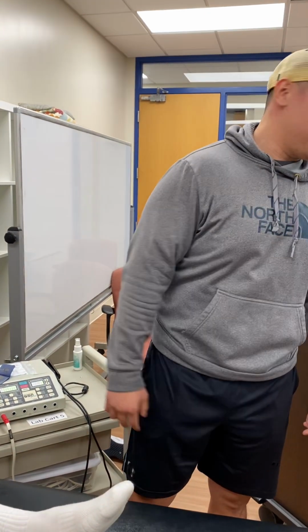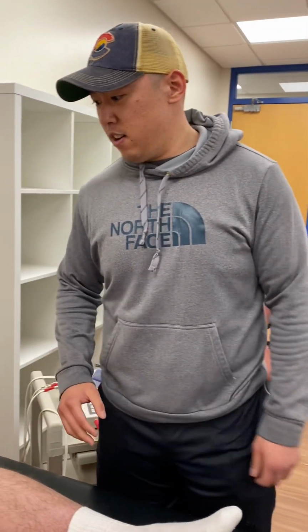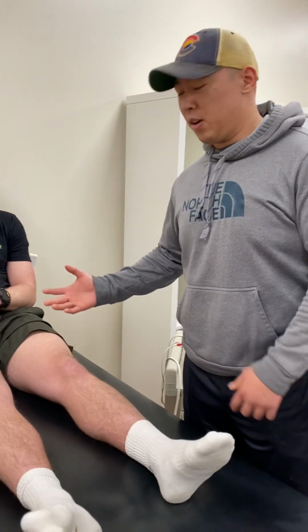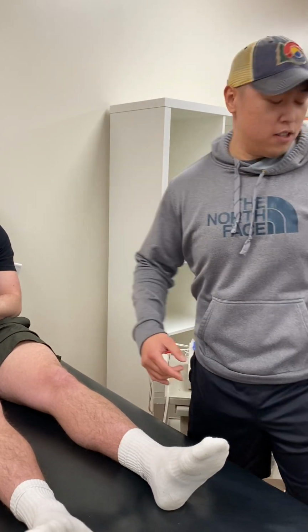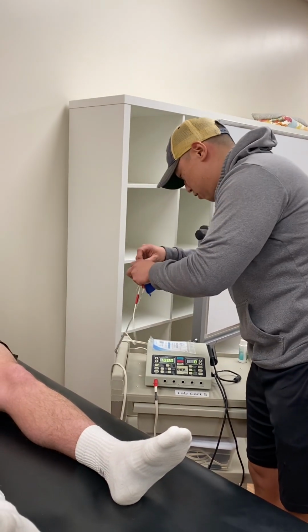The MVC on this is going to be about 50 to 70%. So we're going to get that quad to contract 50 to 70% of what it can do without the use of estim.